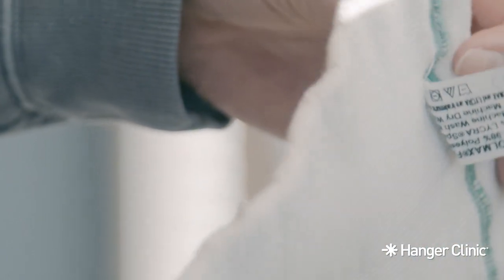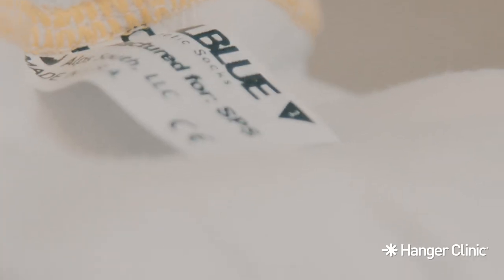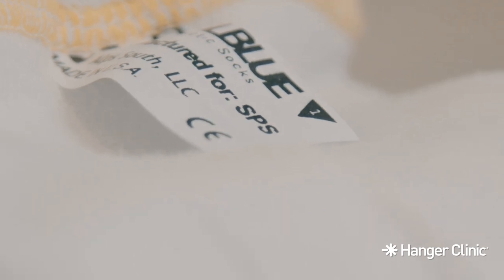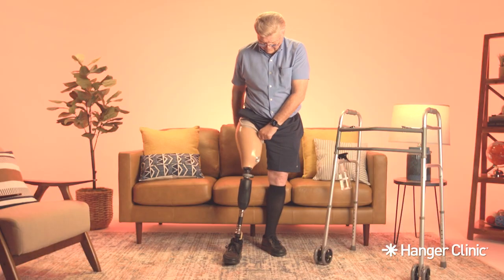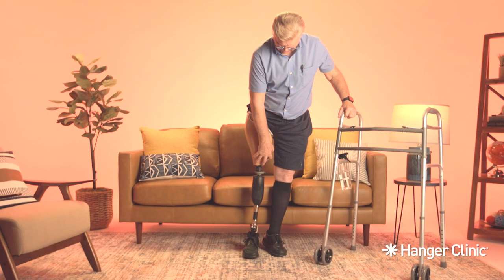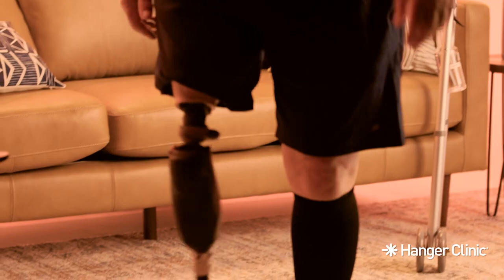Socks come in different thicknesses called ply. The color of the band at the top of the sock indicates its ply. Although these colors typically represent the same ply regardless of the manufacturer, there is a small chance that they could vary. Start by adding a one ply sock and increase ply as needed. If you have added a sock, make sure that your limb still goes all the way into the prosthesis. Your socket should fit snug to your limb. Socks can be worn in multiples — for example, wearing a green and blue sock at the same time means you have applied eight ply of socks. Remove a sock if your limb is not getting all the way into the socket or if the prosthesis suddenly feels too tall. Always take a few steps in place to ensure your limb is secure in the socket and to expel any air before walking.